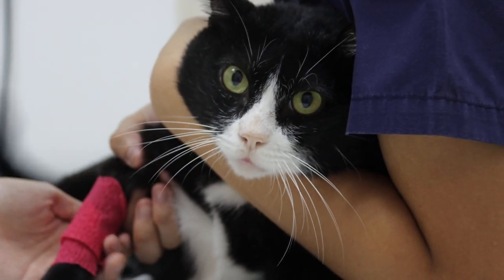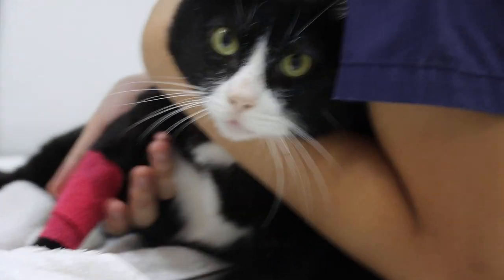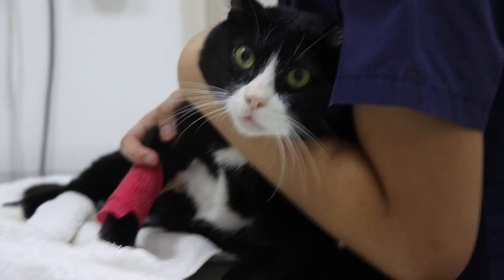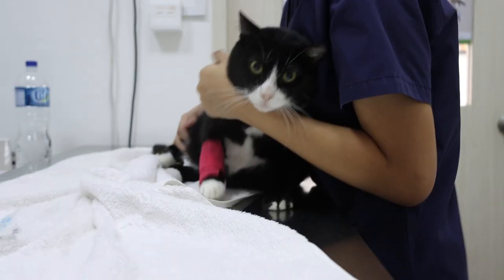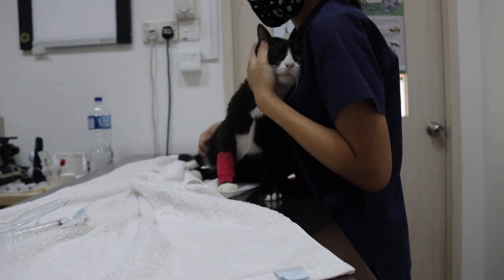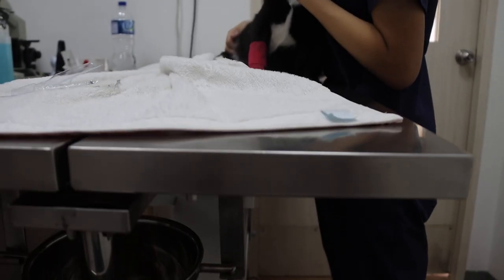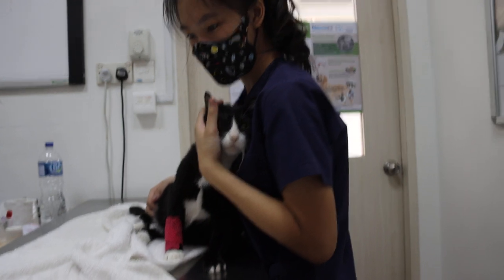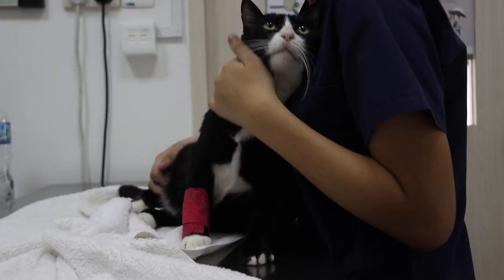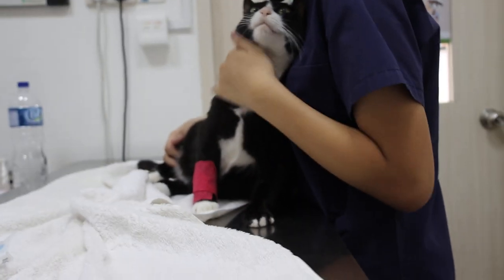This looks like a simple thing but for the golden retriever it's not simple, which is why I made this video. They were trying to do it on the floor but it's not possible. The best approach is to put the animal on a table at the height of the owner and the vet, so that the blood collection is easier.